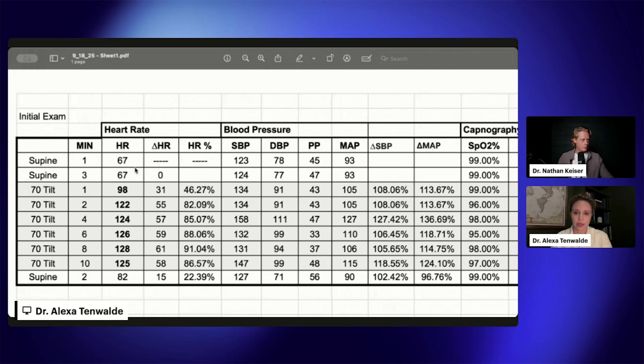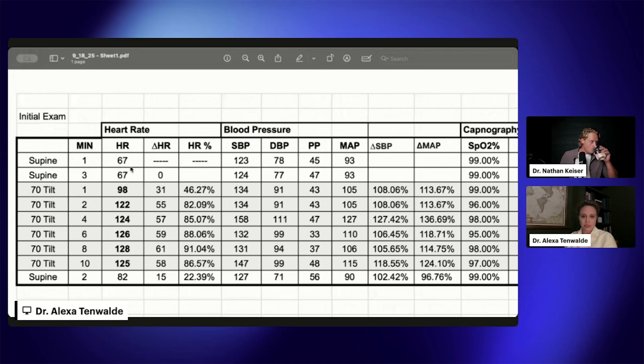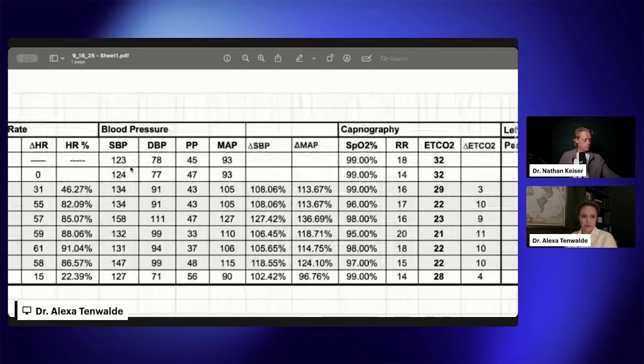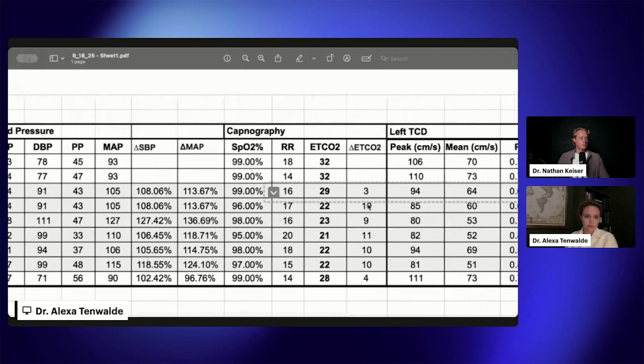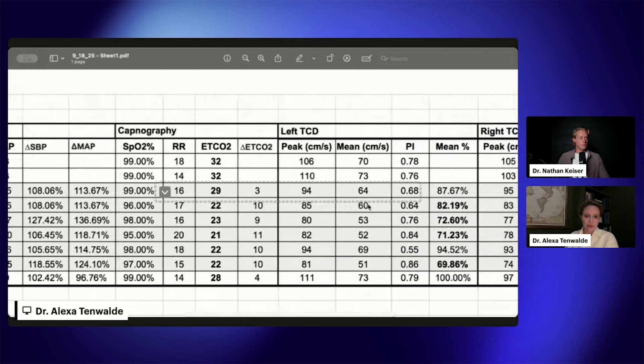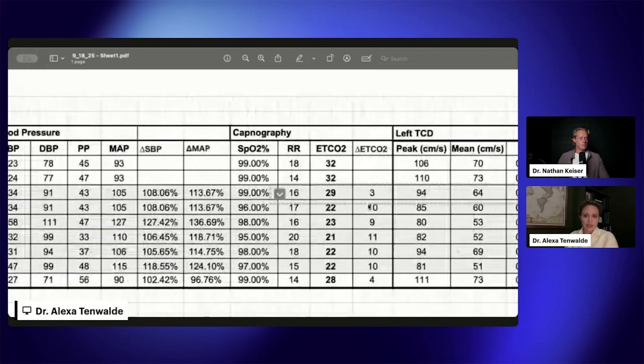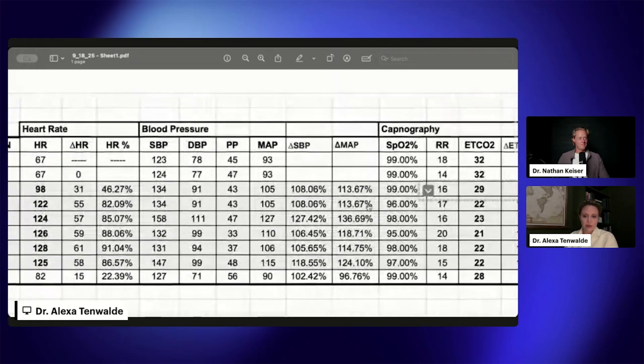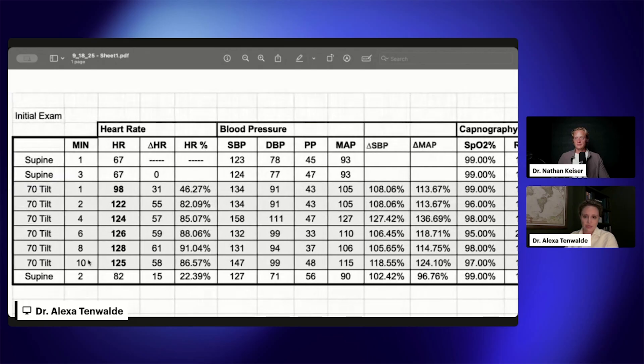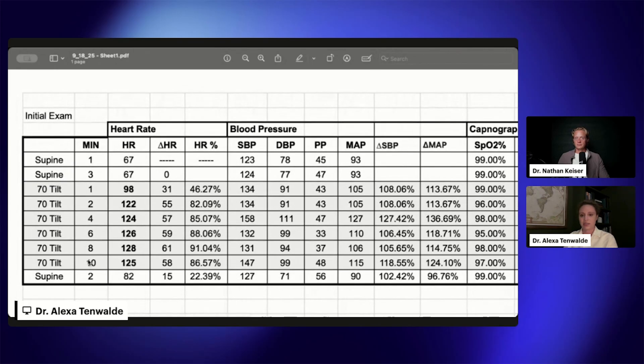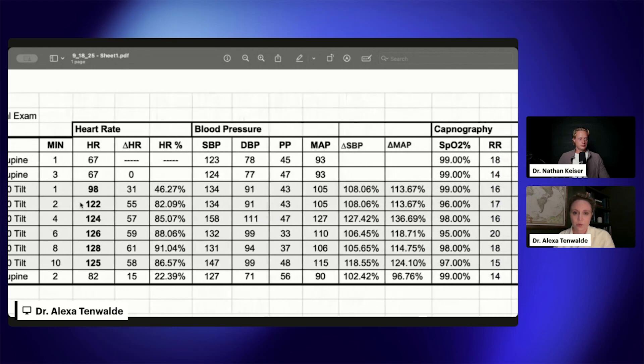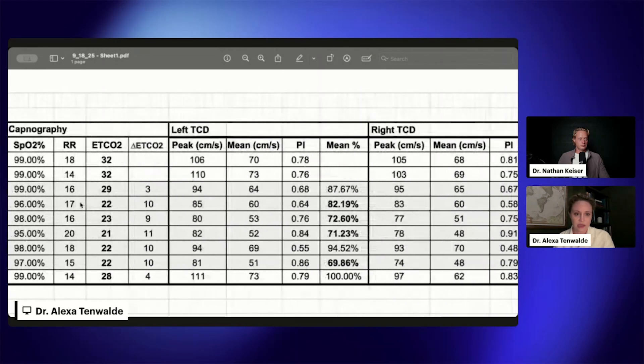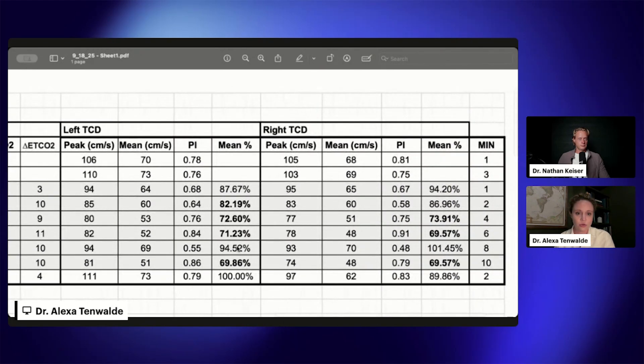This is our first couple minutes of supine and our heart rate here. We can see we're at a pretty decent heart rate. We went over that EtCO2 last week on the stream—super happy we got into that. And then in these darker gray boxes, this is when we actually get into orthostasis. This is where we have that 70-degree tilt.